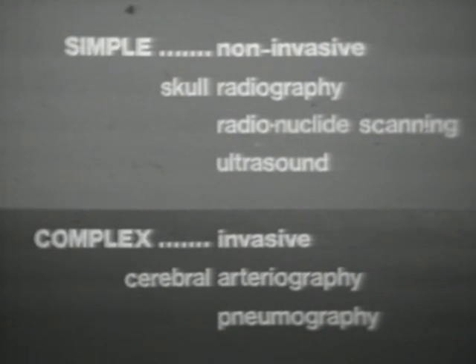Arteriography enables us to look at the vascular structure of the brain, and from displacements, change in contour, pathological changes in fine vessel structure, or disease of the vessels themselves, we may be able to deduce the site and probable nature of the lesion. Cerebral pneumography enables us to see those structures which are normally filled with fluid, that is, the ventricular system, the subarachnoid basal systems, the cerebral sulci, and again, from changes in position, size, and contour, we may be able to deduce what has happened.